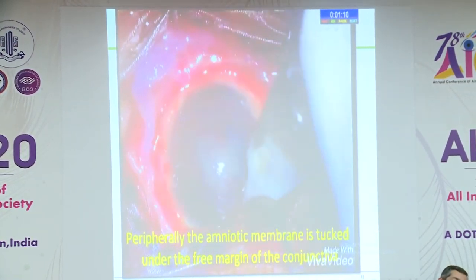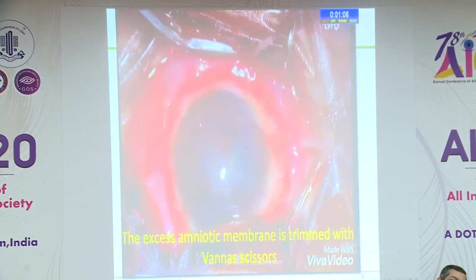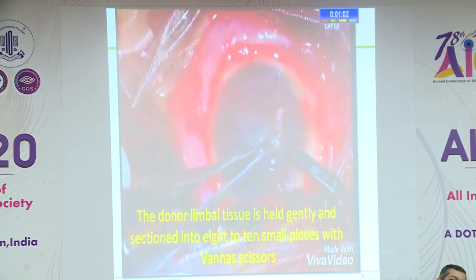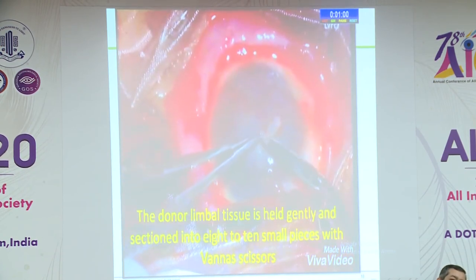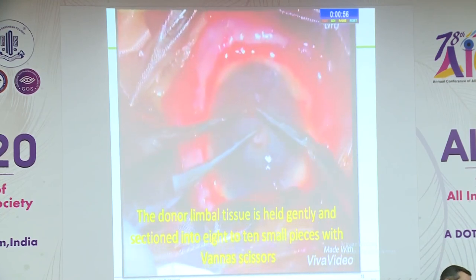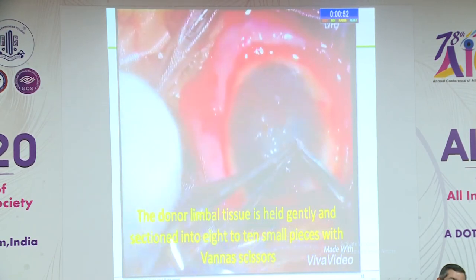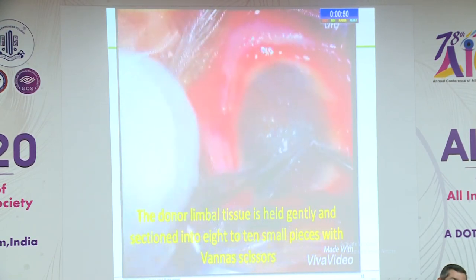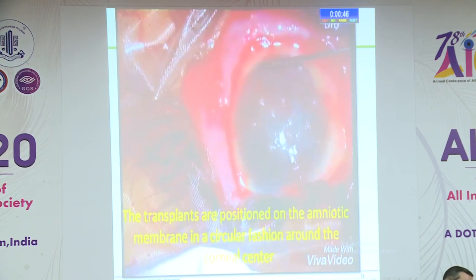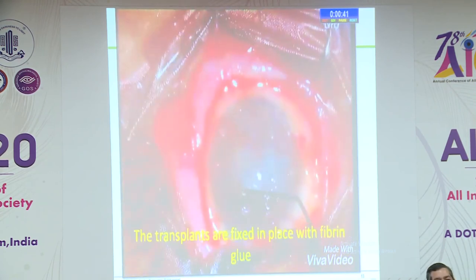And this is just like at the time where you're putting the amniotic membrane. Trim off all the excess with the help of Vannas scissors. And then take the donor limbal tissue, hold it gently, section it into 8 to 10 small pieces with Vannas, or you may also use a Teflon block and cut it over that. It depends upon the surgeon's comfort at that time. And these are typically stuck in a circumlinear fashion with the help of fibrin glue. And at the end, one could just put a bandage contact lens.